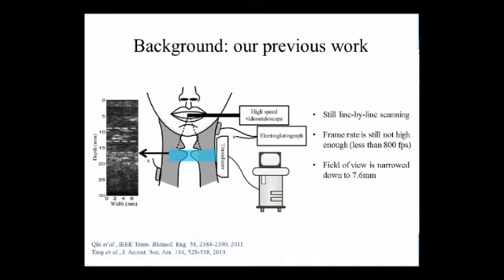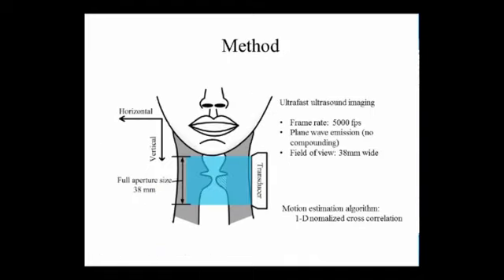So if we want to investigate the unsteady state of voicing, the actual frame rate of the ultrasound imaging should be much higher than this. And then we thought, why not use plane wave ultrasound imaging here?